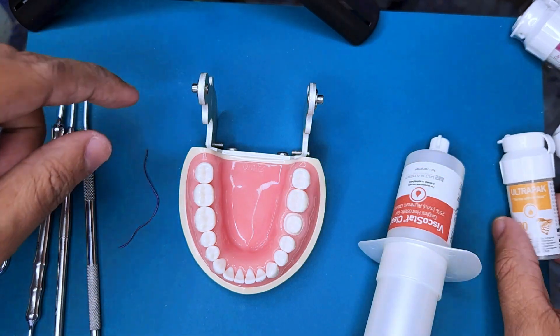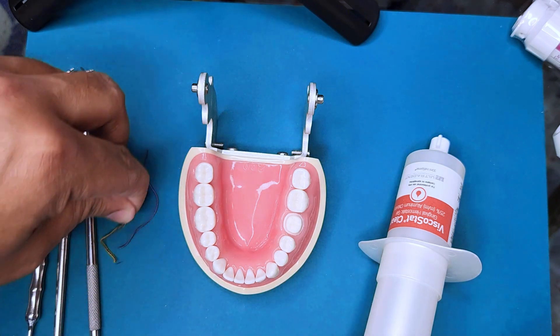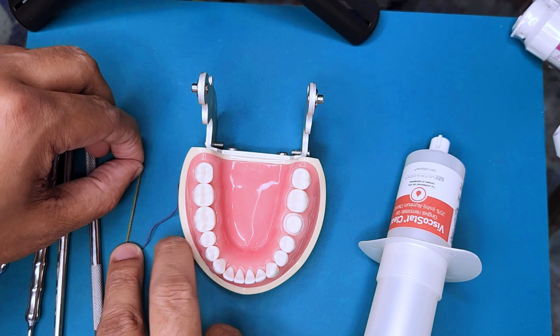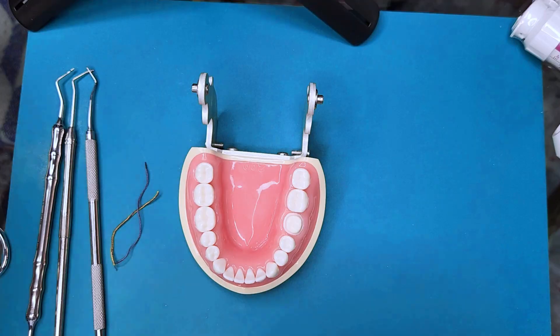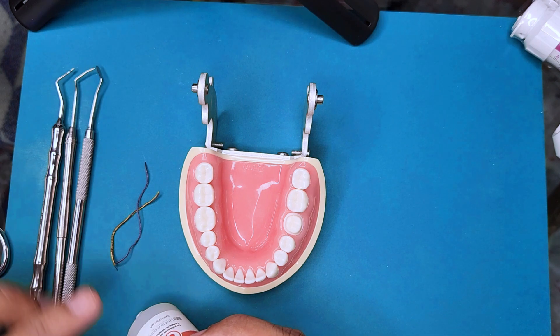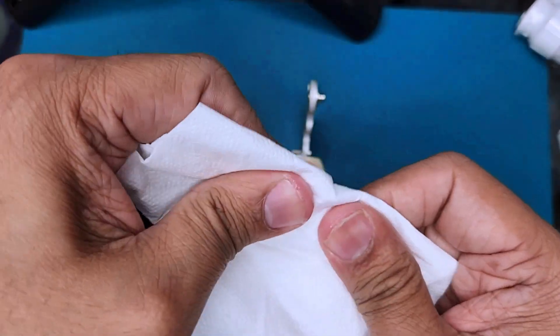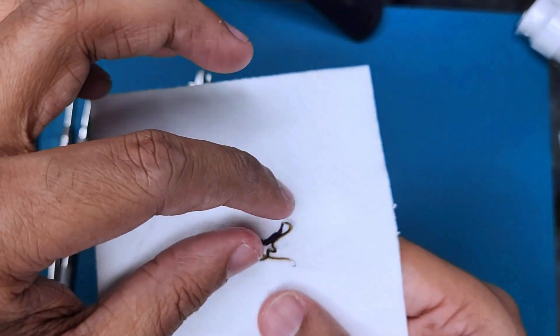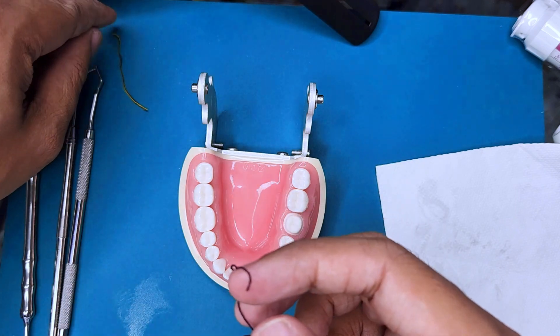The cords I like to use are from Ultradent — knitted cords. My favorite numbers are triple zero, double zero, and zero. Numbers one, two, and three I hardly use. Once I've decided on the exact cord length, I take a drop of my astringent, dip the cords in it, rub them nicely, then take a tissue and dab them. Make sure there is no excess aluminium chloride — the cords should just be moist.